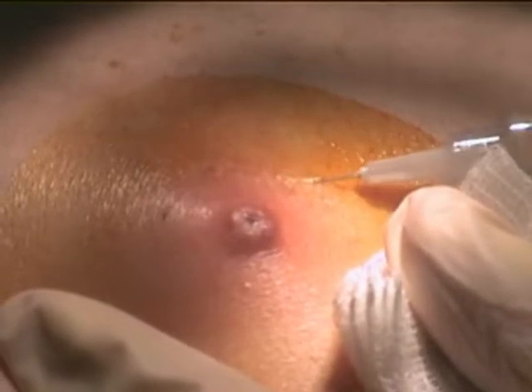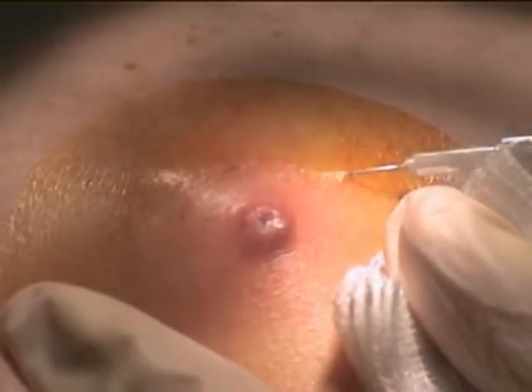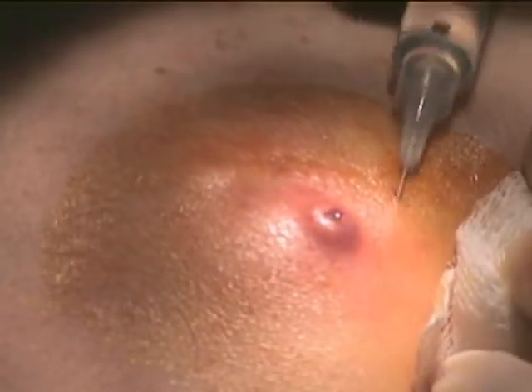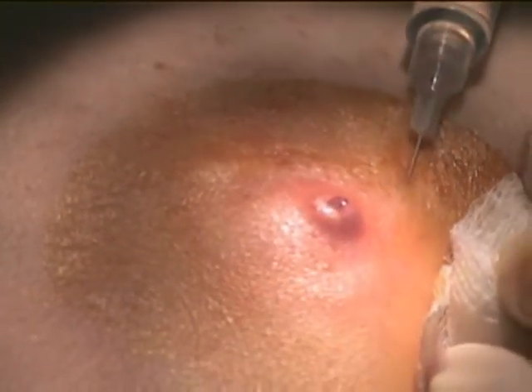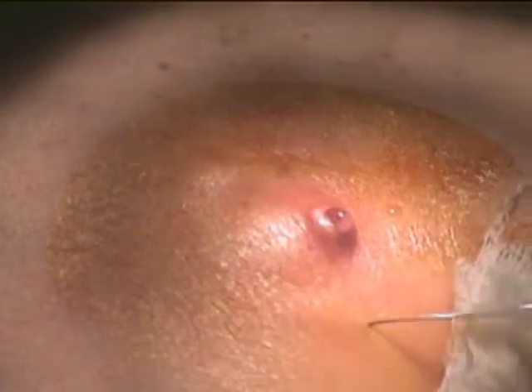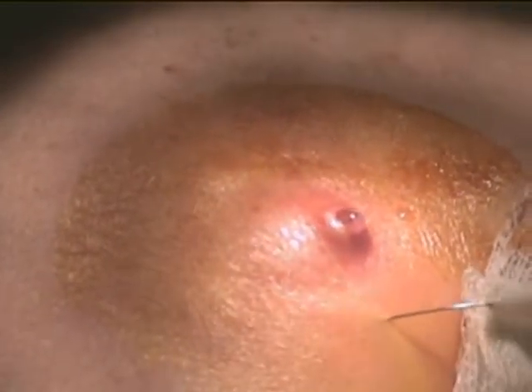Administer a field block with local anesthetic to allow an adequate incision to be made. Avoid infiltration of the abscess cavity. Concentrate on anesthetizing the perimeter of the tissue around the abscess.